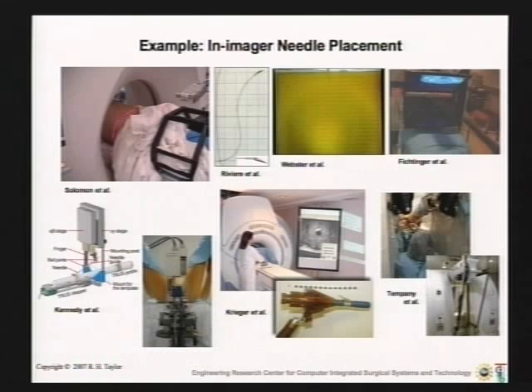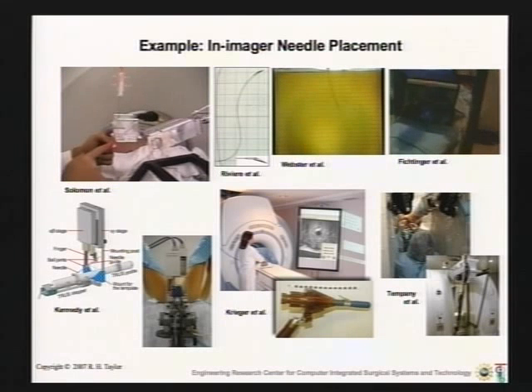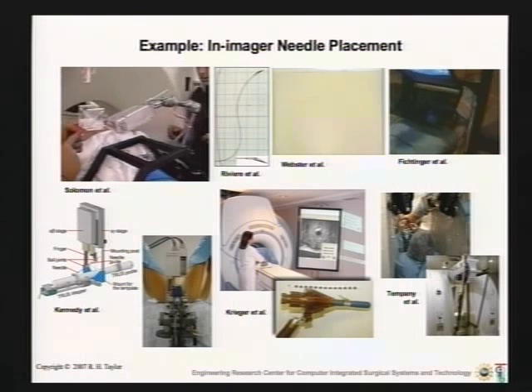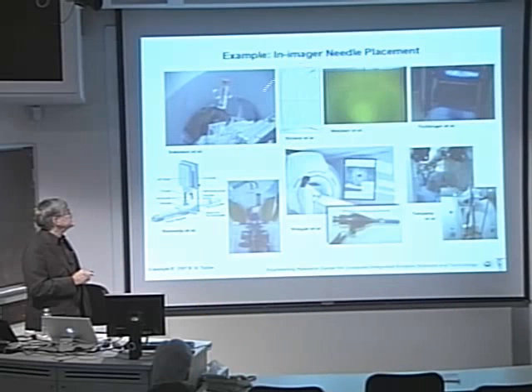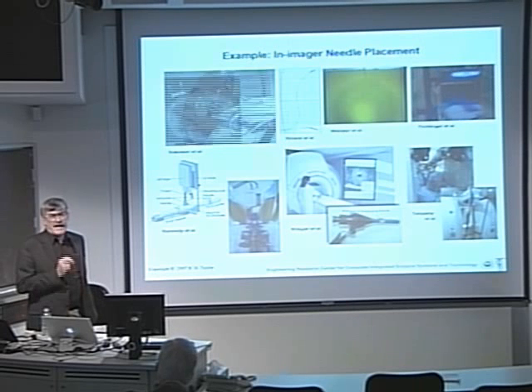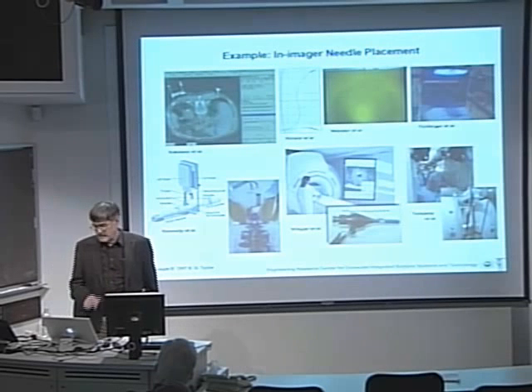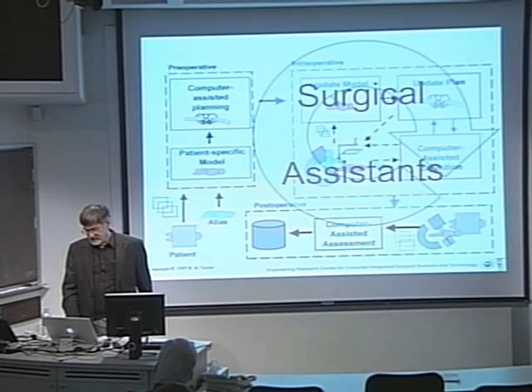In our own center, a lot of the emphasis in our research has been in a variety, we call it needles everywhere. But the delivery of precise therapies at the end of some kind of a long needle or thin tube accurately placed on a target under image guidance. And again, I will be saying a fair bit more about this later, so right now it's just to give you a feel.